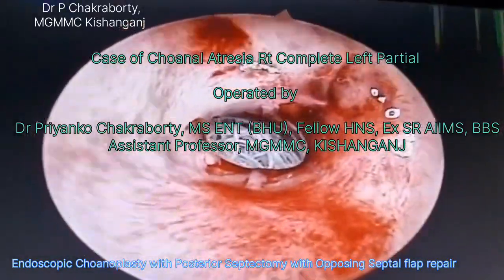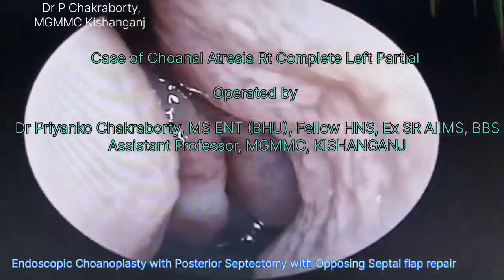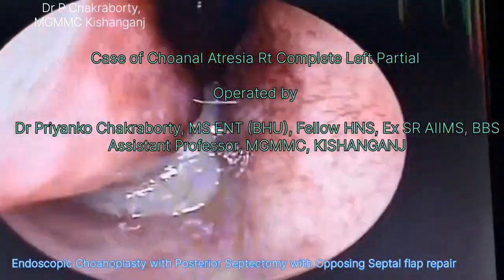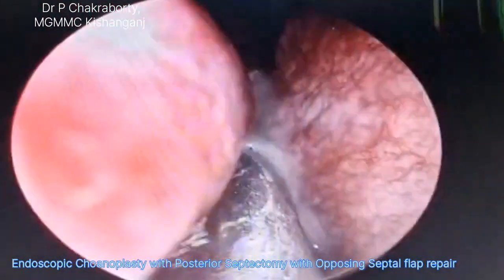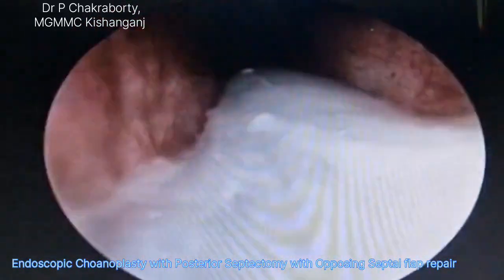Hello. So this is a case of choanal atresia with left side partial blockage and right side complete blockage. So you can see we had shown the left side first. There is a very small opening. It's a membranous atresia with a small opening in the left side.